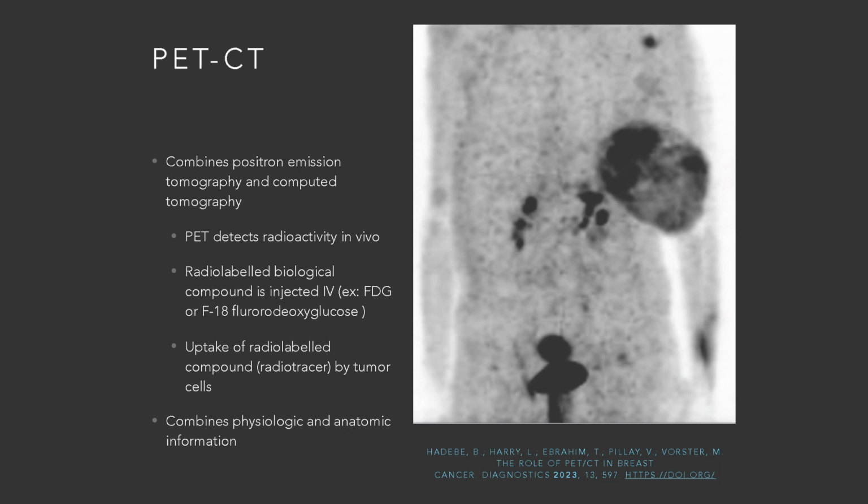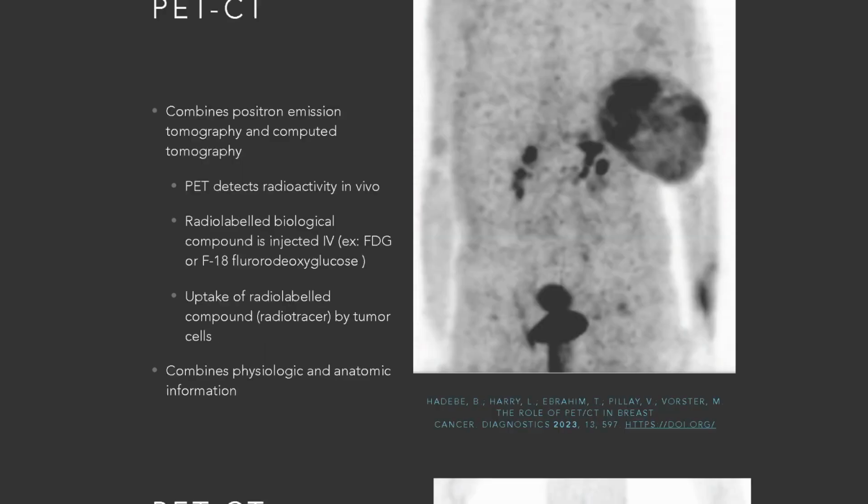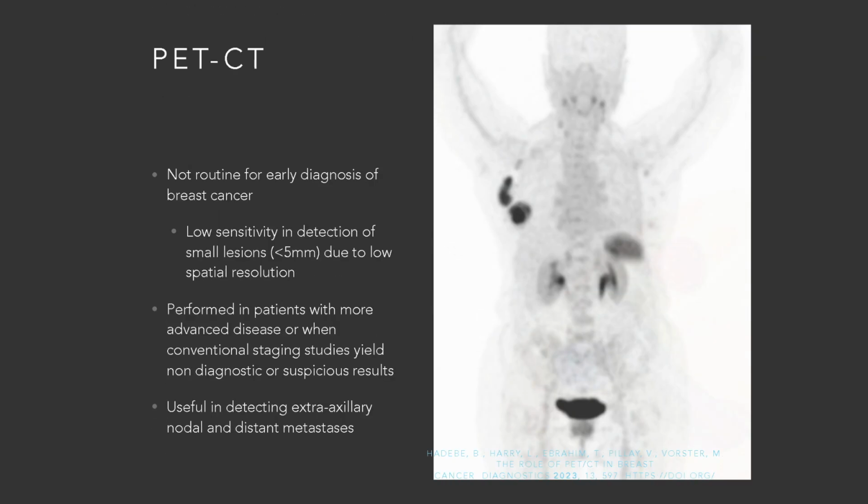So the nice thing about PET-CT is we're combining this physiologic information with anatomic information that we get from the CT. PET-CT is not routinely used for early diagnosis of breast cancer.